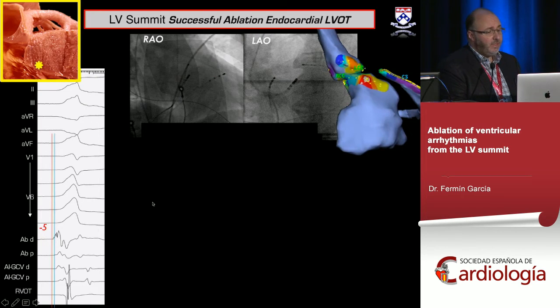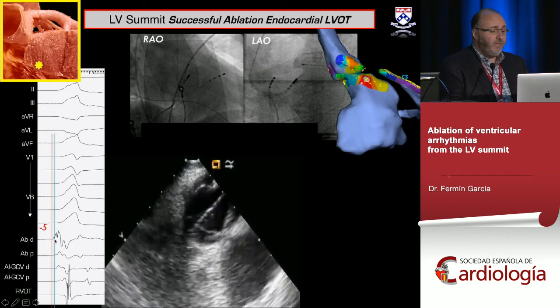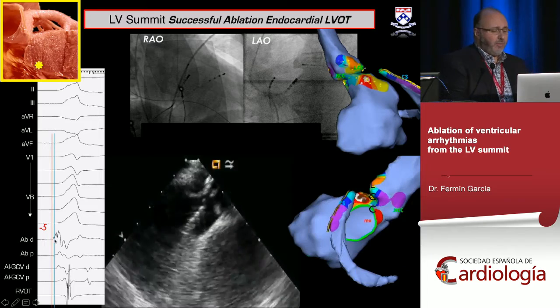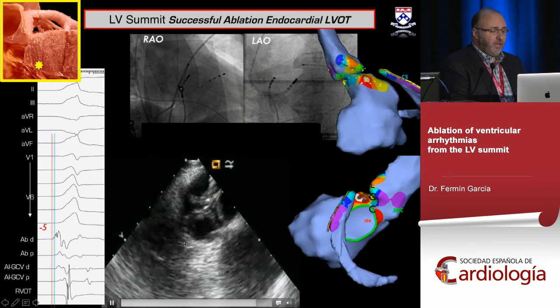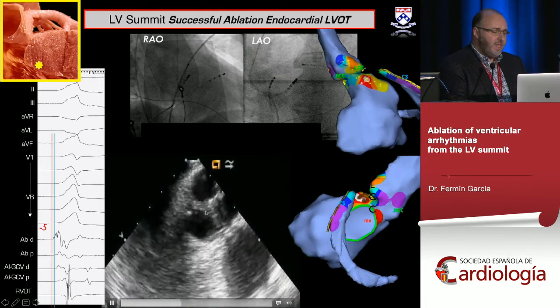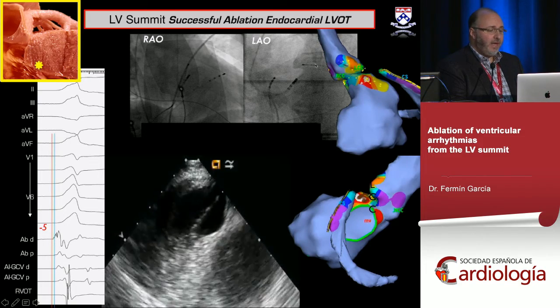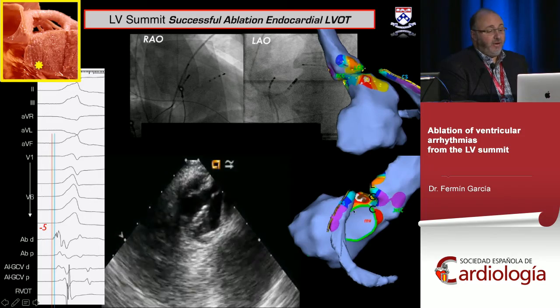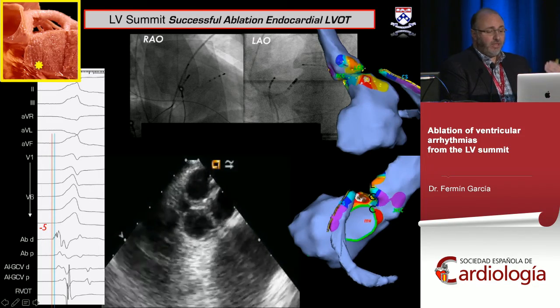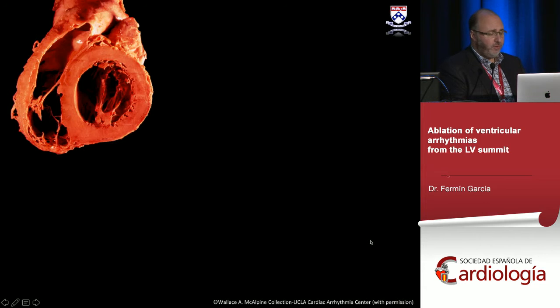Here we are even earlier in the endo — and echo is very helpful. You can see our catheter right at the top of the LV ostium below the left coronary cusp — much earlier than the decapolar catheter outside. This patient's arrhythmia origin on the LV summit is closer to the intramural segment, not truly epicardial — but you have to map carefully to know this.